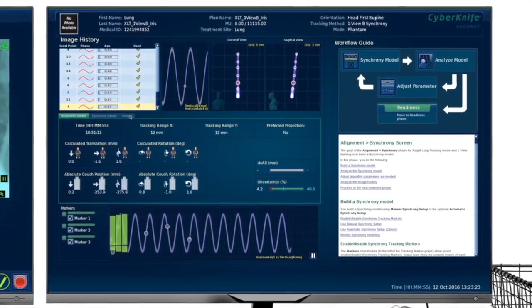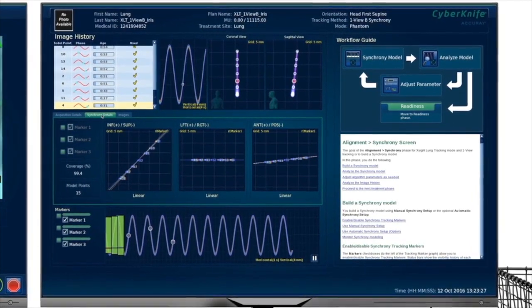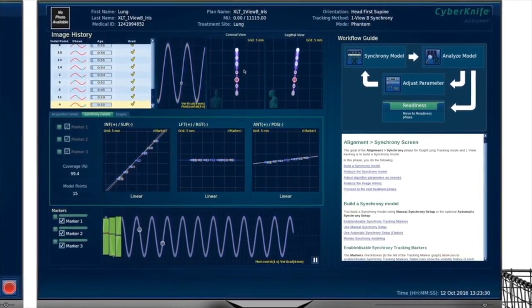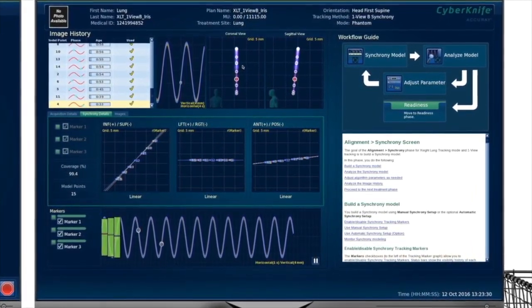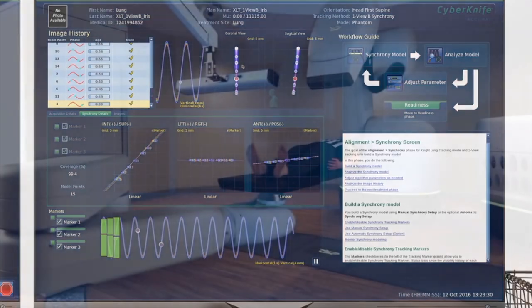During treatment delivery, the system automatically acquires additional X-ray images, continually validating and updating the correlation model. The images and the model are carefully monitored by the clinical team via the treatment delivery software's intuitive display.